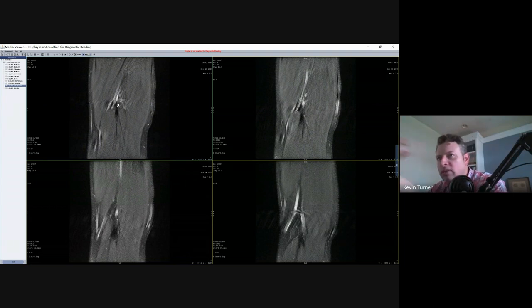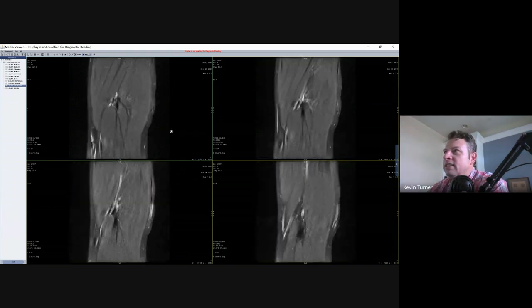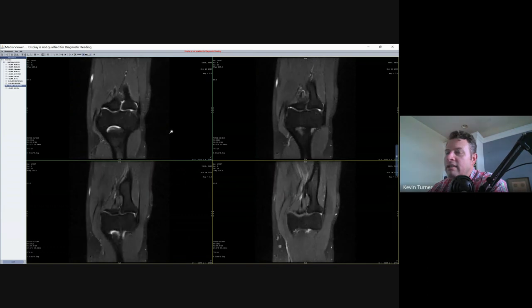So when we're making pulse sequences in MRI, what we're deciding here a lot of times is we're setting up gradient information to give us, obviously, the resolution. And then we're setting up the TR and TE to give us the correct contrast. We usually run multiple different orientations and multiple different contrasts. Two axials with different contrast, but then an axial and a coronal with the same contrast. All right.